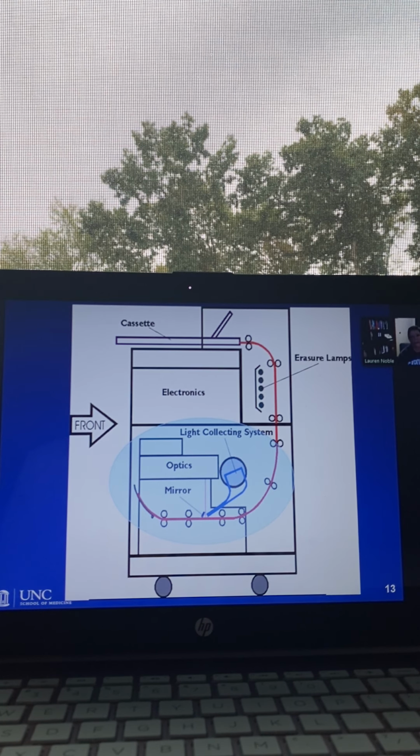If you are too overexposed, more towards the side of being grossly overexposed, then you may very well get a message on the reader device that tells you to run it through another erasure cycle. You can do just an erasure cycle without running the plate through the processing mode. I'll show this to you one day when we come back and we're down in the lab. There's a button you can push and it will take the plate out, run the plate down to here, turn the lights on, and then put it back in the cassette.